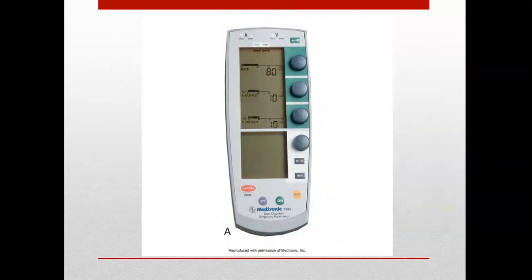Okay, so this is what a modern electronic external pacemaker looks like. This looks identical to what we used at St. Bernard's and at NEA. Other hospitals may use different types, but this is just the one that I've seen used around here.